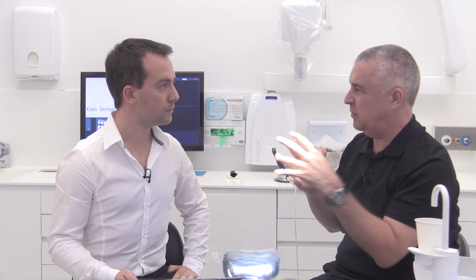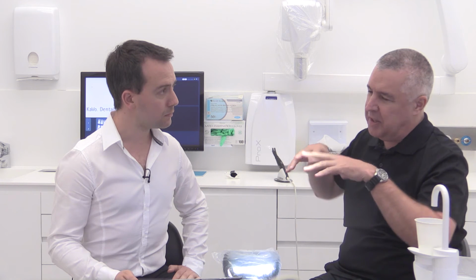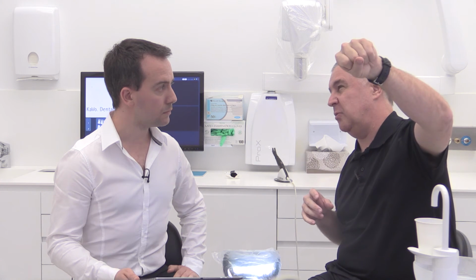And that's also true if you're using an LED tip, for example, to do transillumination of anterior teeth. You see a lot more when you've got the operating light turned away, because you've got a darker background field. And while the tip acts as a bit of a shroud to reduce the problem, if you've got a halogen light, I'd have the halogen light turned away.